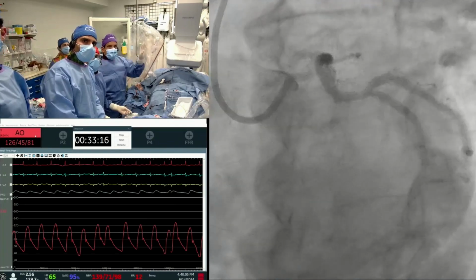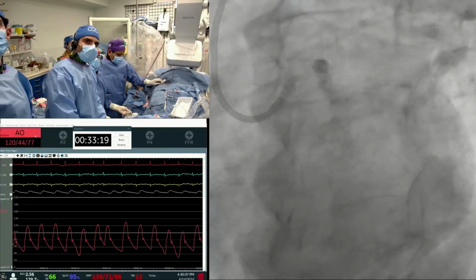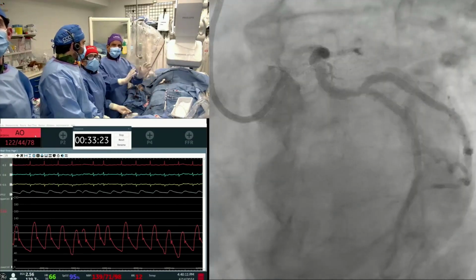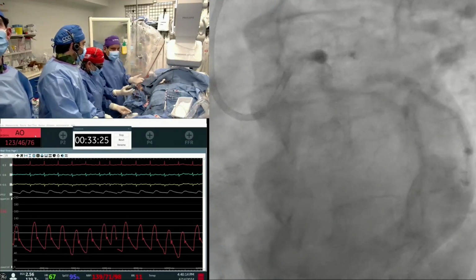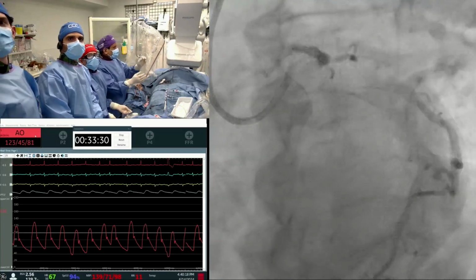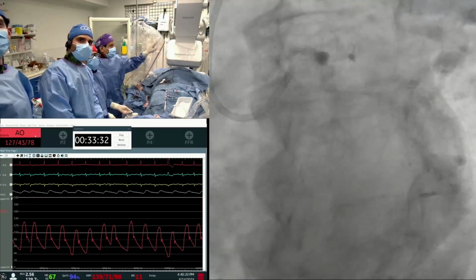And as you saw, it's a radial case because today my goal is to make all the techs happy. So radial was complaining that no radial case is done. And this is the radial case. Of the 10, we have 1 radial. So at least 10% by the end.